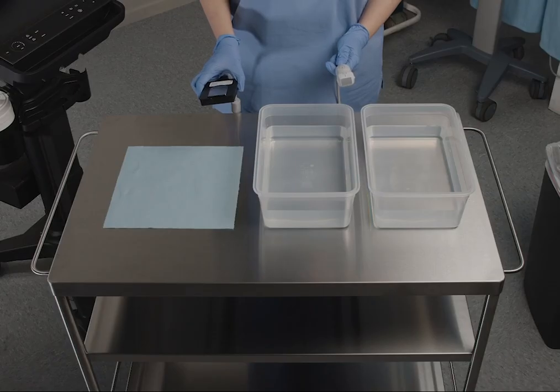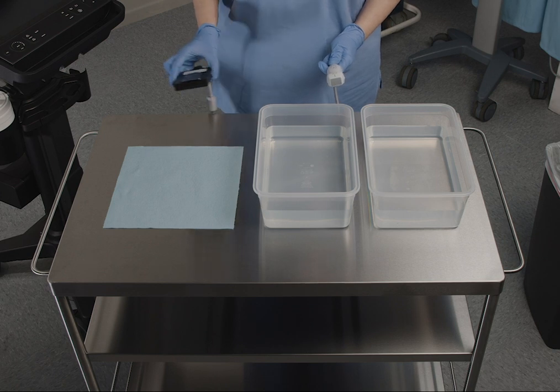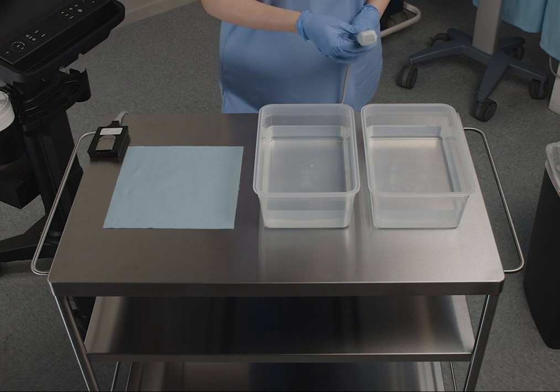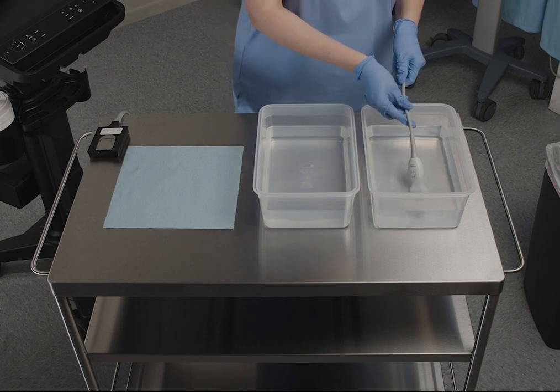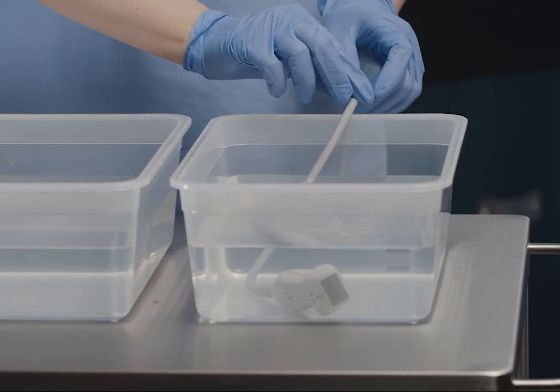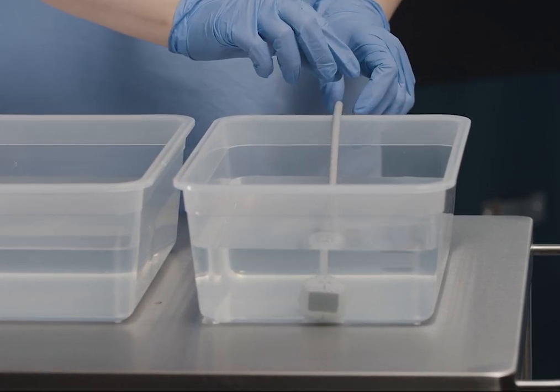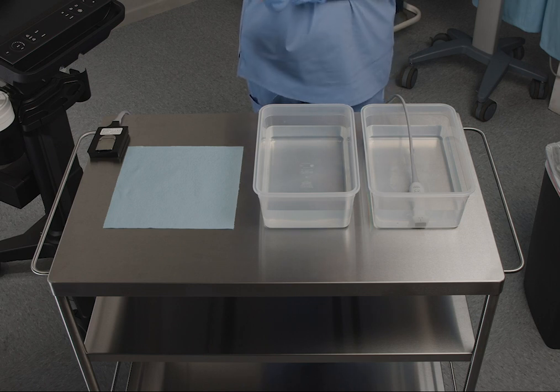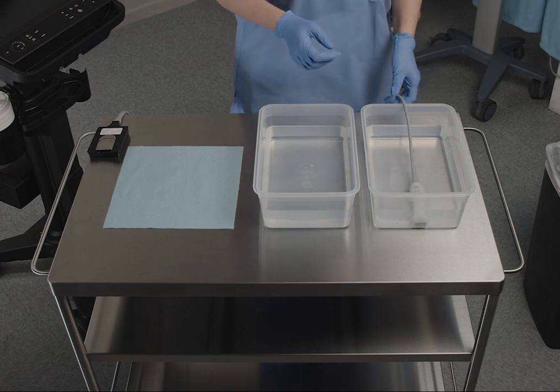Mix a disinfectant solution that has been approved by Fujifilm Sonocyte. Be sure to follow the label instructions for solution strength and contact duration. Immerse the transducer and cable into the container holding the disinfectant solution, making sure you leave the transducer connector and at least 12 inches of cable out of the solution.